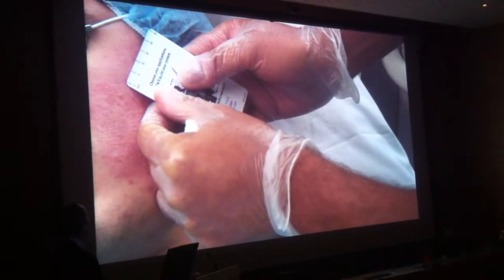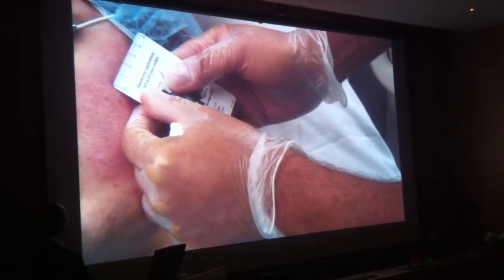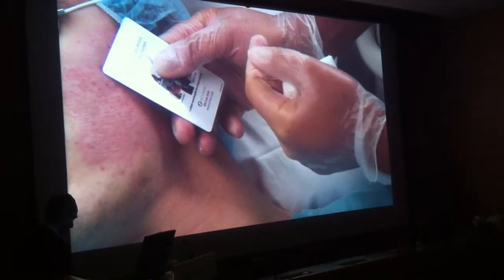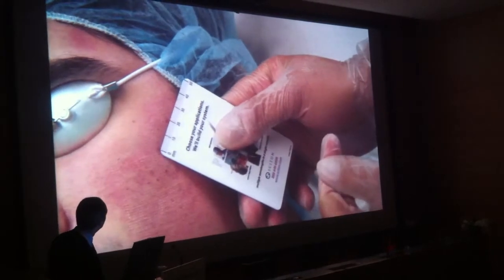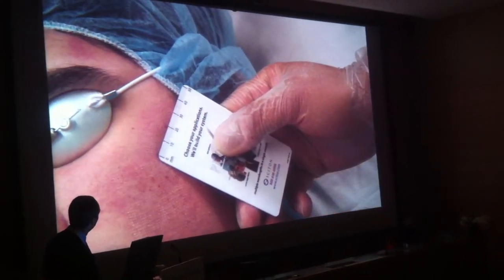And again, this is quite a mild treatment. This is thanks to the coagulative properties of this. So you can see at least 1 millimeter, even with this soft treatment. I don't know if you can see it. It's already slightly less than 20 millimeters. I don't know if it's evident. From here, it's quite visible.